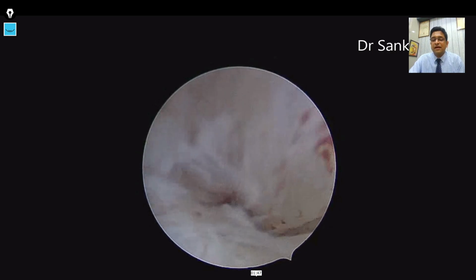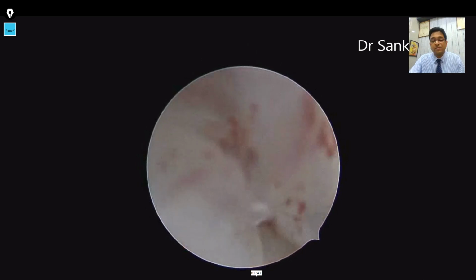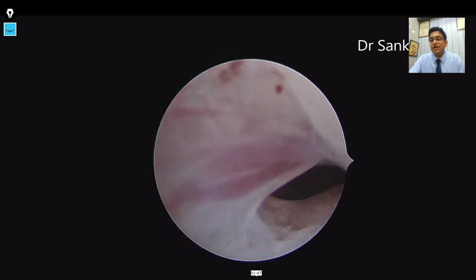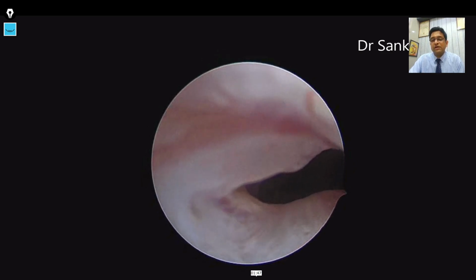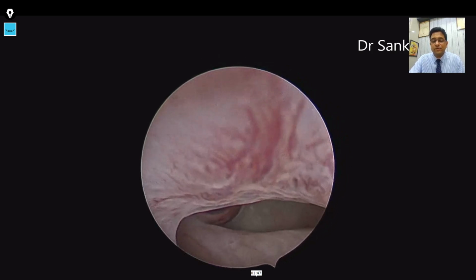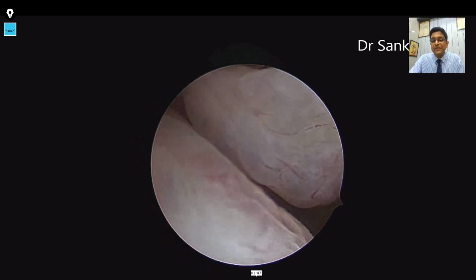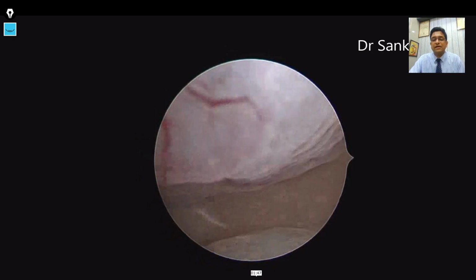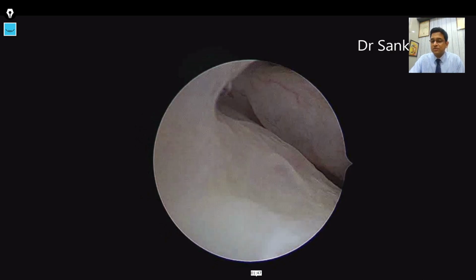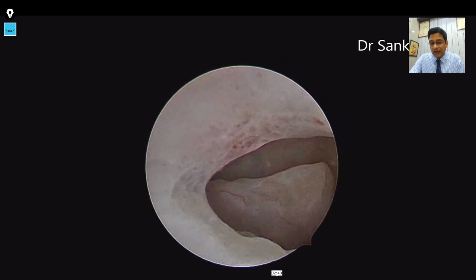So you see here I have created an adequate opening and I feel now with an adequate amount of pressure, I should be able to enter inside the uterine cavity without any problem. So here, without using a dilator, I am now able to enter inside the uterine cavity and visualize the polyp which is growing inside. Again, with a dilator, it may not be possible to even reach inside the uterine cavity because the possibility of creating a false passage in such a case is very, very high.